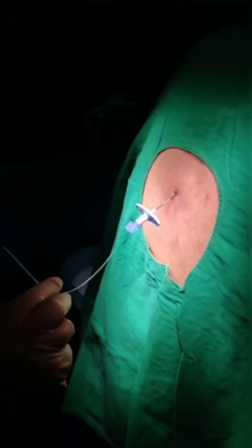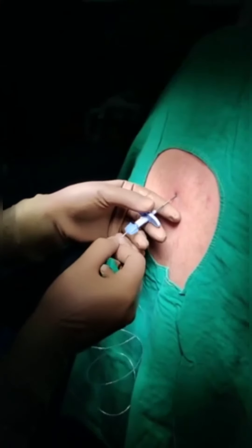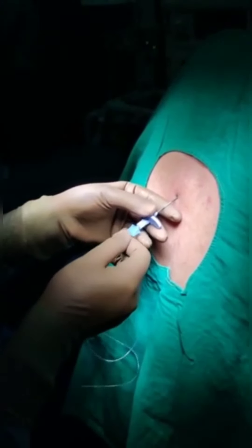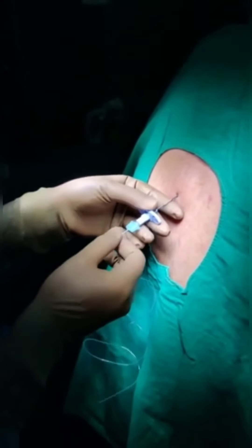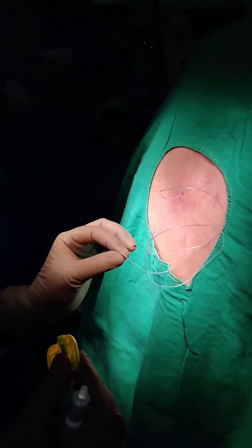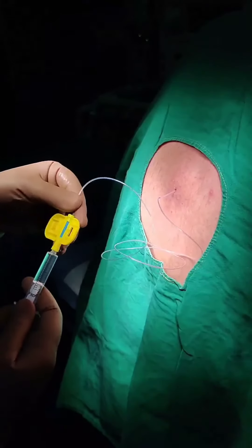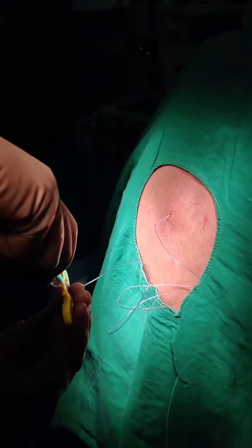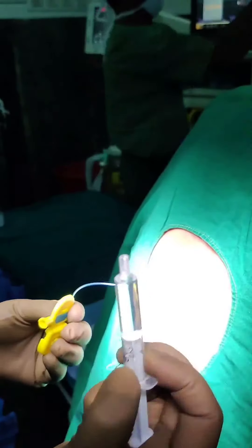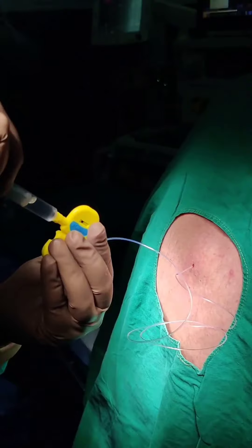Now connect the introducer to the Tuohy needle and introduce the epidural catheter very gently through the Tuohy needle into the epidural space. Note the markings on the Tuohy needle to record the depth at which the epidural space was reached. Introduce the catheter at least 5-6 cm beyond the depth at which we reached the epidural space. Avoid withdrawing the catheter with the needle in the back, as it may shear the catheter. Gradually withdraw the Tuohy needle over the catheter without dislodging the catheter from the epidural space. Now attach the distal end of the catheter to the yellow connector and aspirate to check for any blood and CSF in the catheter. Inject about 1 ml of normal saline and confirm free injection without any resistance. Disconnect the catheter from the connector and check for a fall in the saline column in the catheter as you raise the catheter higher.